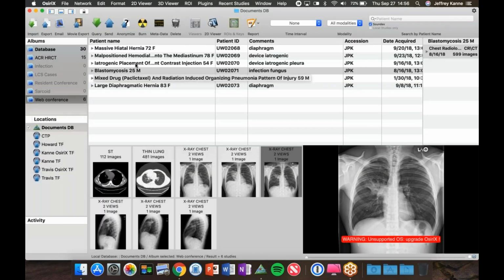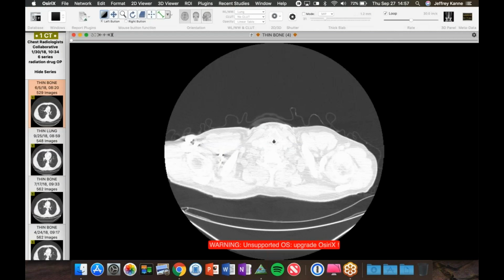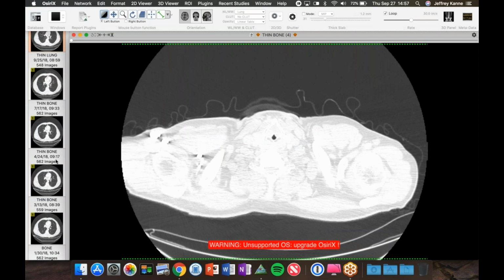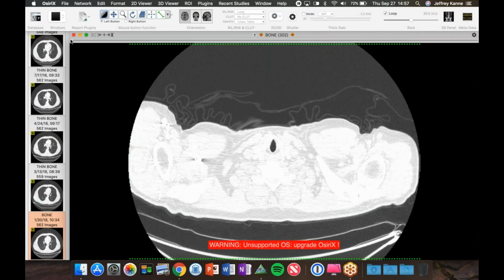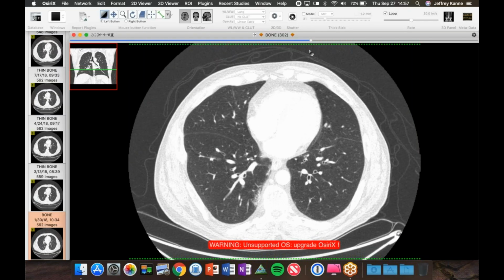Very interesting. All right. This is kind of a cool case because I have a lot of serial imaging. So this is a patient with a head and neck squamous cell cancer who has metastases, is on a taxane, paclitaxel, and received some radiation to the spine last fall, sort of around, I think, November, December, for a metastasis for palliation. And over serial radiographs developed this finding.